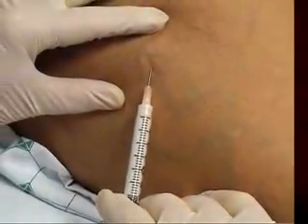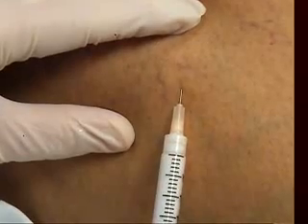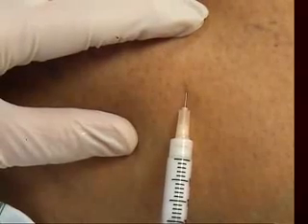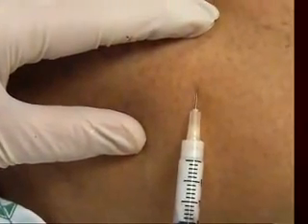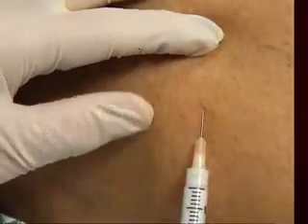Little needle here, keep very still, it's very good. Into that, and there it is. Foam technique again for these vessels that are about 2 millimeters in diameter, and I think you can see immediately they've disappeared very nicely. Now, one question is how much you have to put in and how long they need to be foamed. I think 15-20 seconds is probably enough.